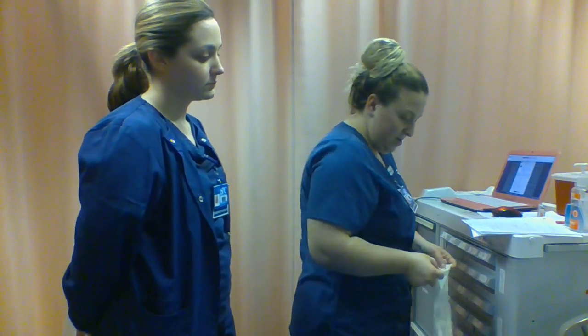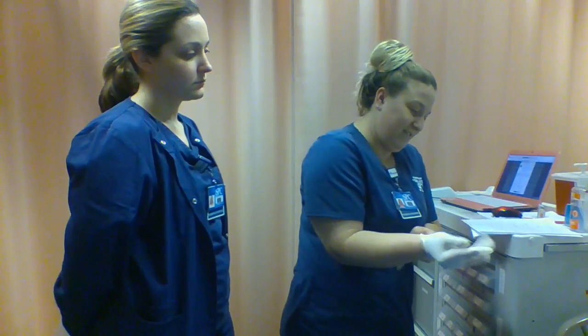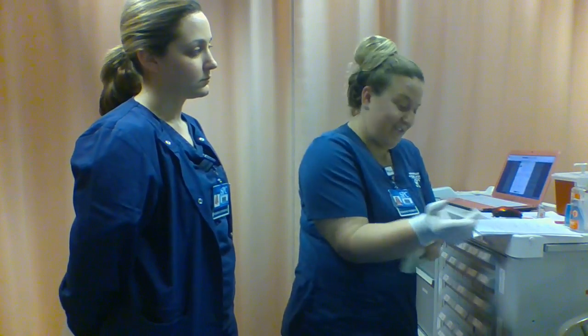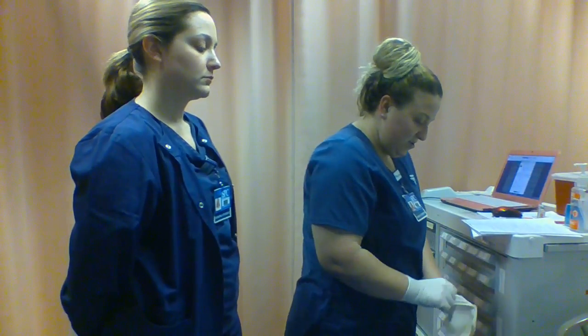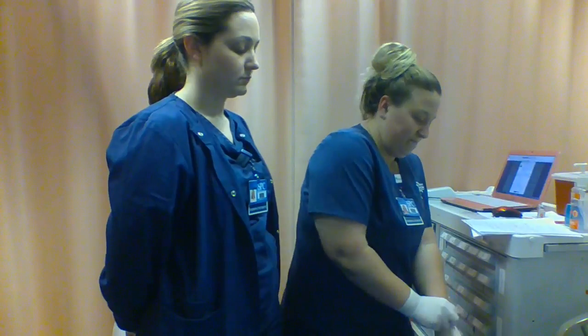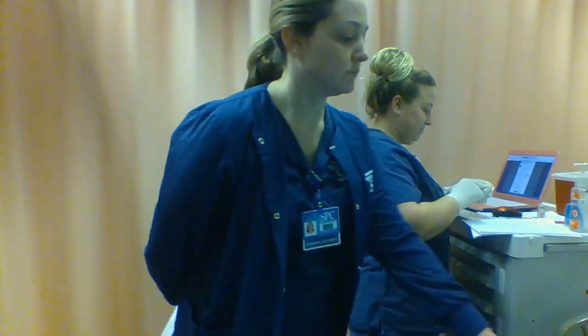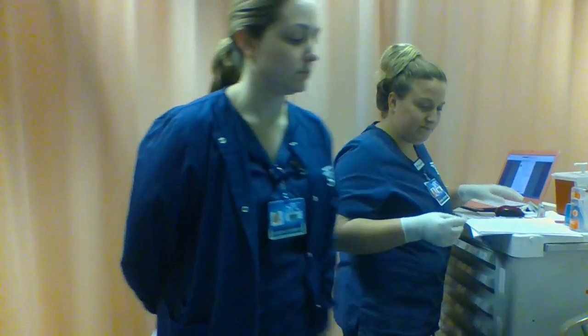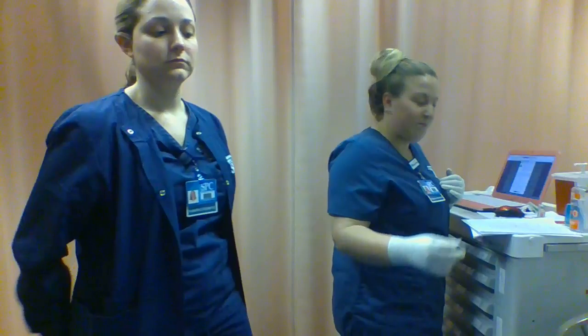Alright, and can you tell me your name and birthday? Light, 67. Thank you. And do you have any allergies? Nope. All right. We're going to go ahead and give you your insulin in your left arm. Okay. Go ahead and clean your arm. And point it down there.